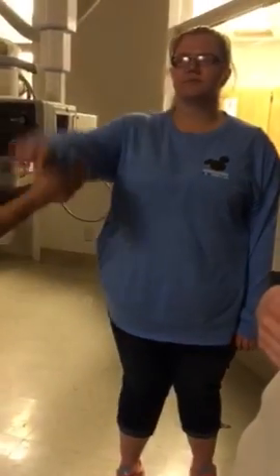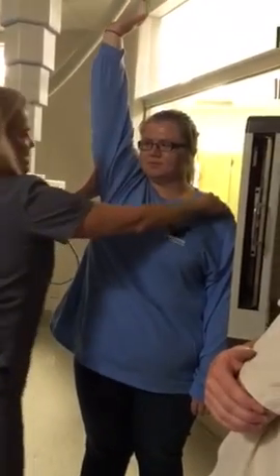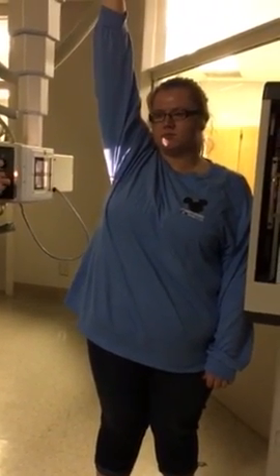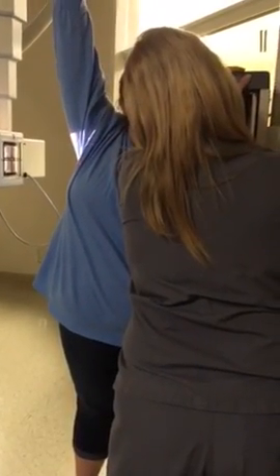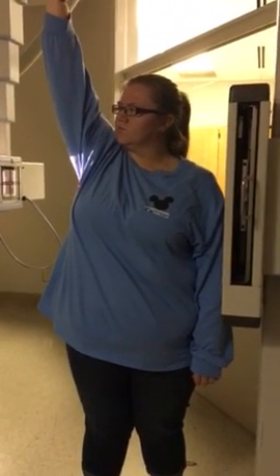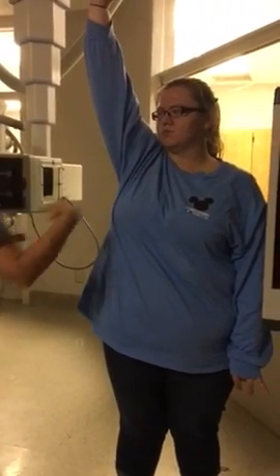Relax that, bring this one up. See how that one's lower and this one's higher, right? So they're not going to be superimposed. You just want them to relax their hurt arm down. Okay. So you see how it goes this way. This is going to be lower and this one's going to be higher. Shoot through the armpit, it's going to exit out the humeral head.